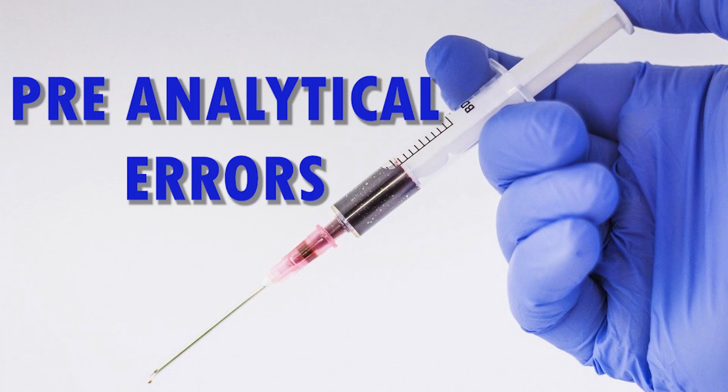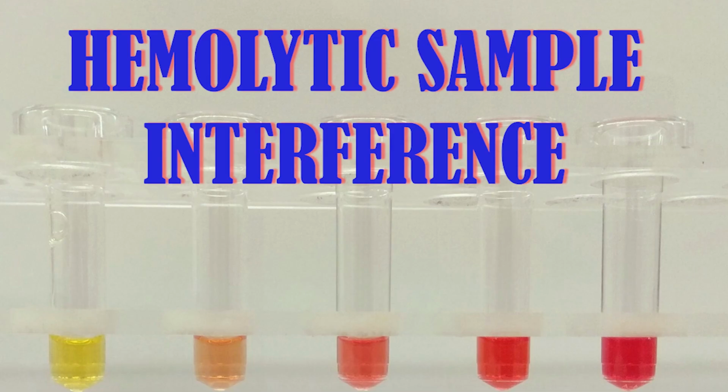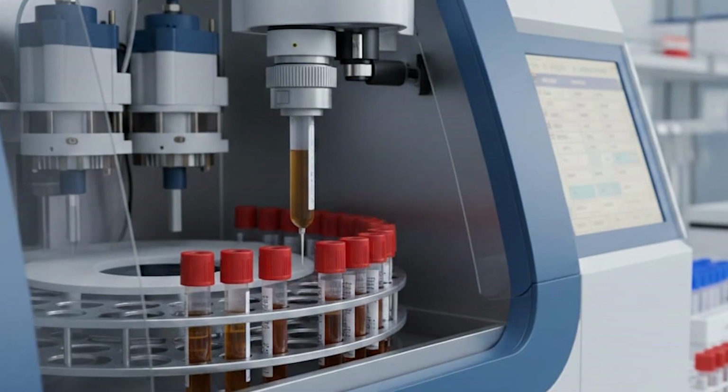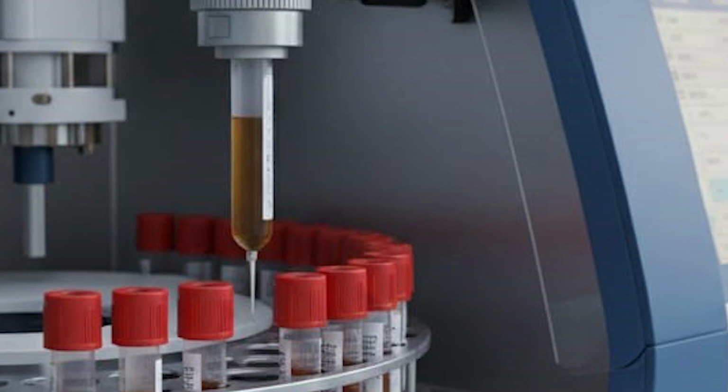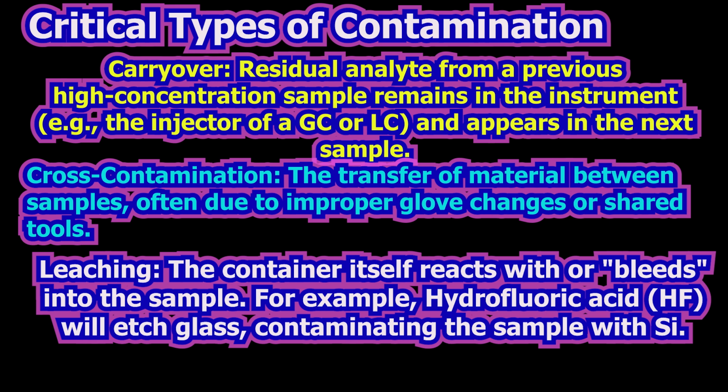Next, if we don't have any correlating results, check for any possible issues with the patient sample. Check the patient sample for hemolysis, lipemia, or fibrin clot. These can interfere in test results. For example, the hemolysis of RBCs can release potassium to the serum and cause increased potassium results. A small fibrin clot can partially block the sample aspiration probe and decrease the test results. If the sample is not suitable for testing, order a new draw and do not release these results.